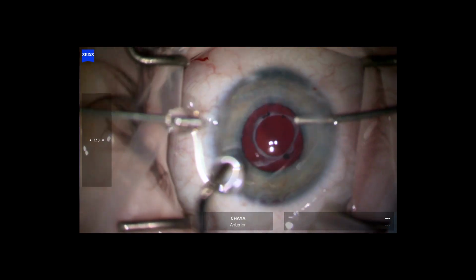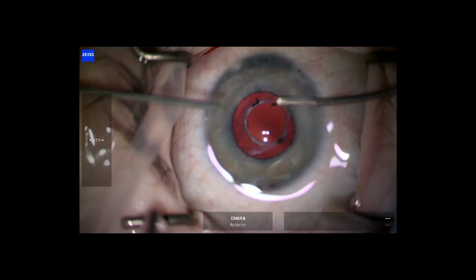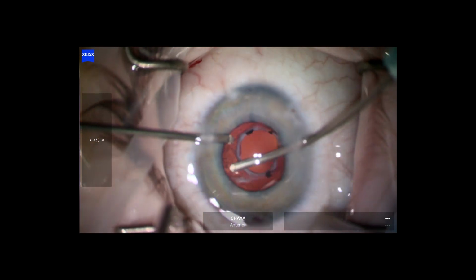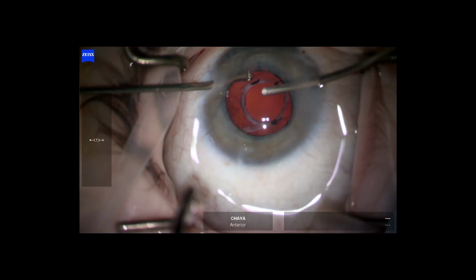When inserting the lens, I will sometimes use an anterior vitrector to widen the capsulotomy, and then I will optic capture the lens, meaning that I will leave the haptics in the sulcus and I will push the optic edges through the capsulotomy. This produces an even more stable and centered lens.